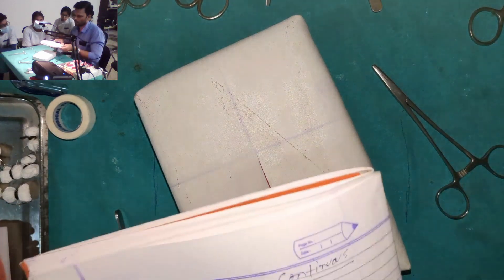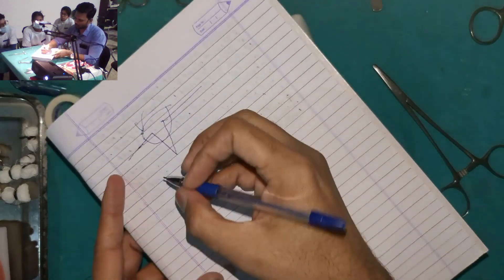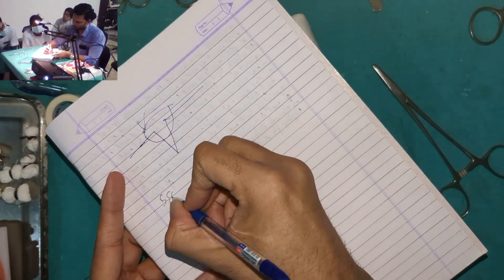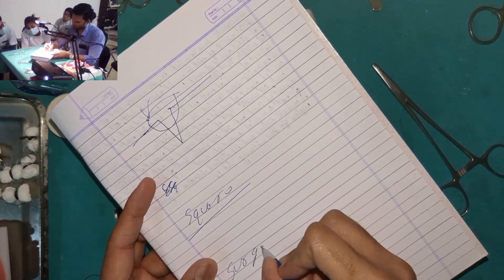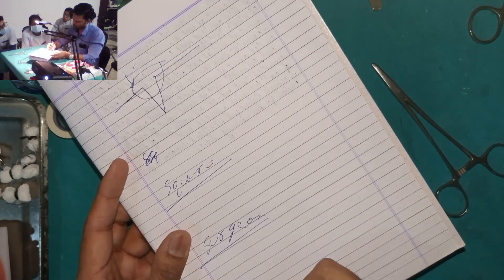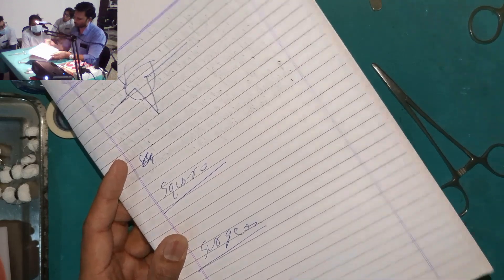So now we will tie the knot. So there are three knots. One is square knot, surgeon's knot, and granny's knot.